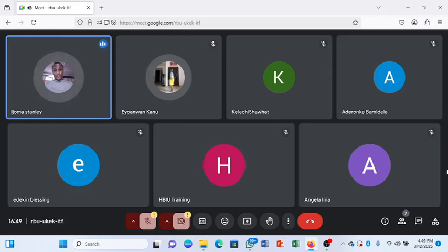We mentioned it earlier when we were discussing blood bank, that the bottle used is the red cap. Most tests done in the blood bank use the red cap bottle. You call it the red stopper or the red cap. In the hospital, you hear something like, "Can I get a red cap bottle?" Those are used mostly for tests done in the blood bank or serum-related tests in the chemistry lab.